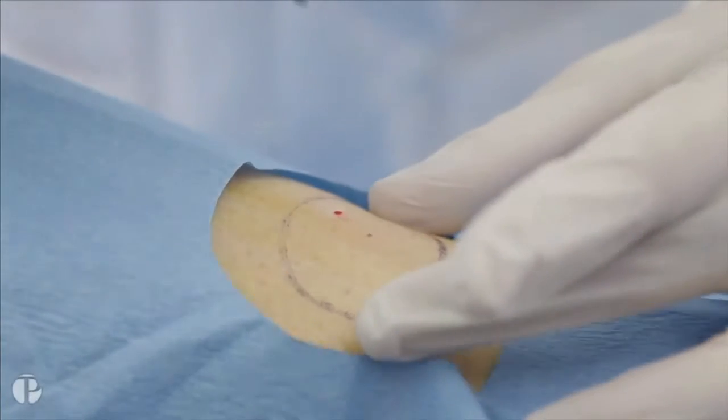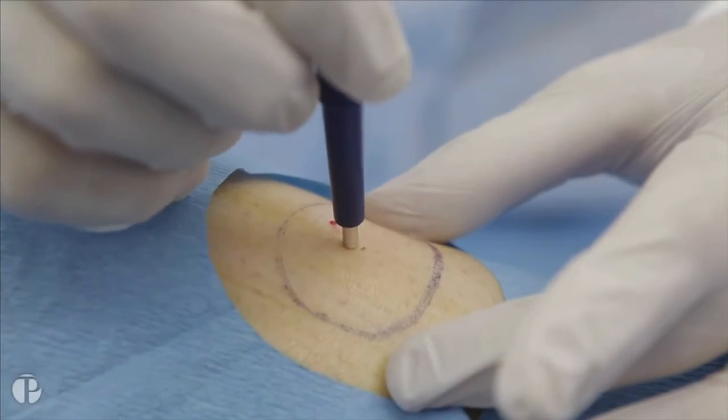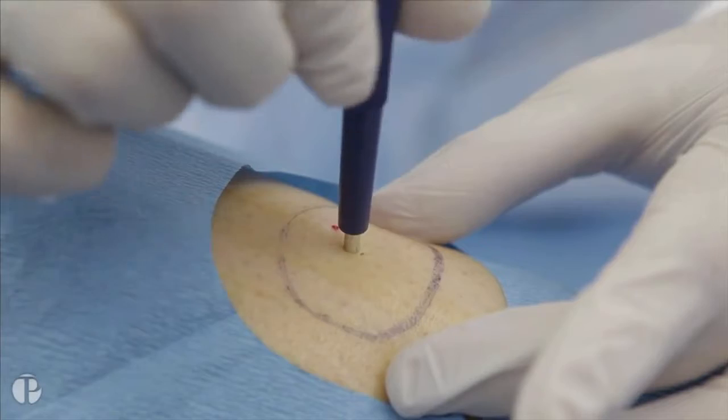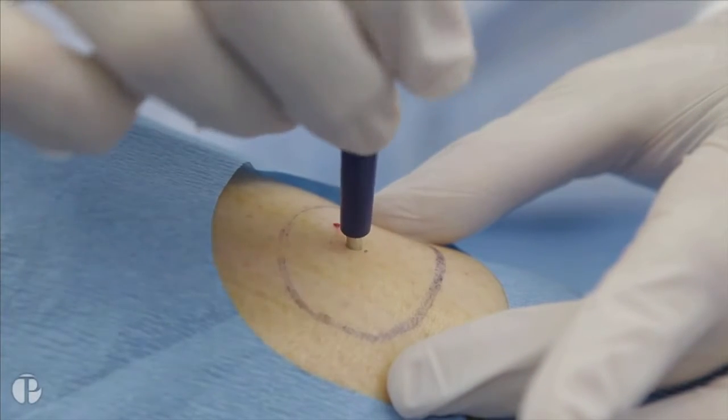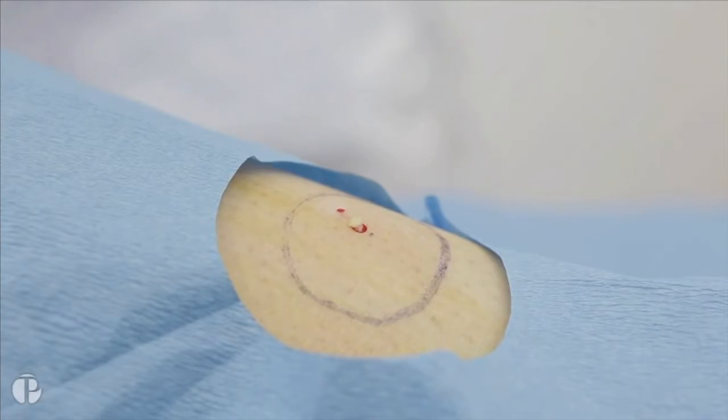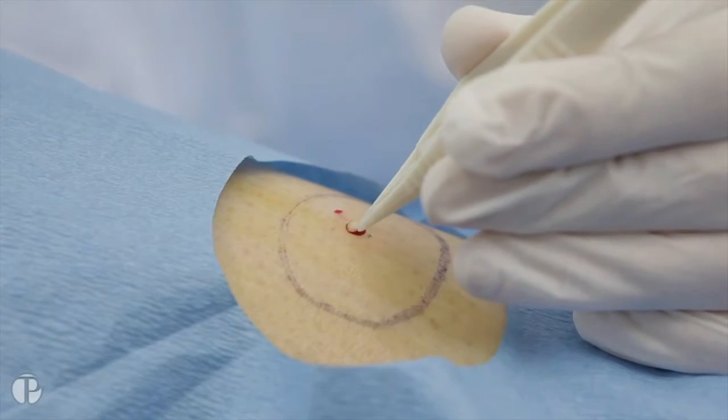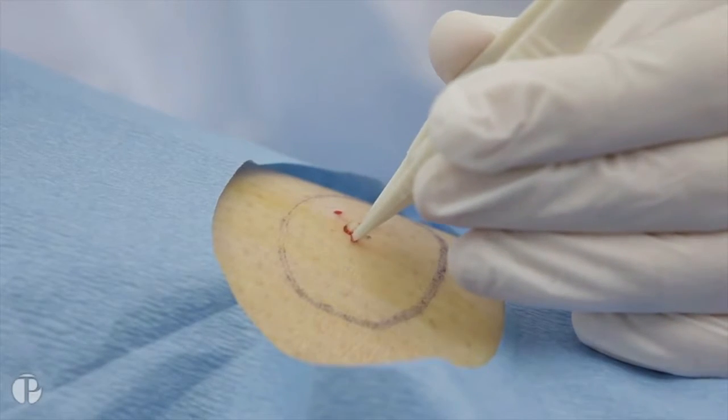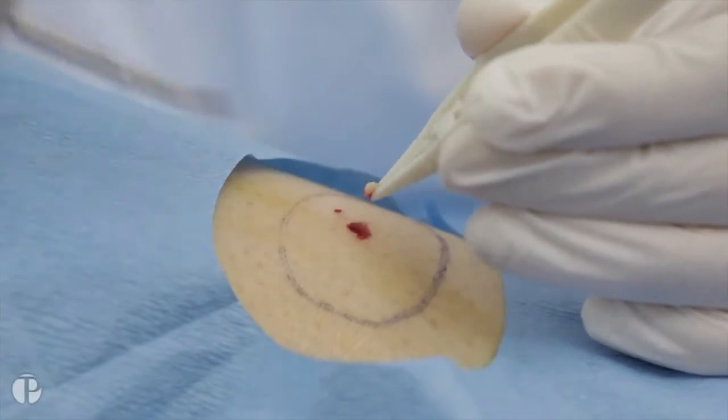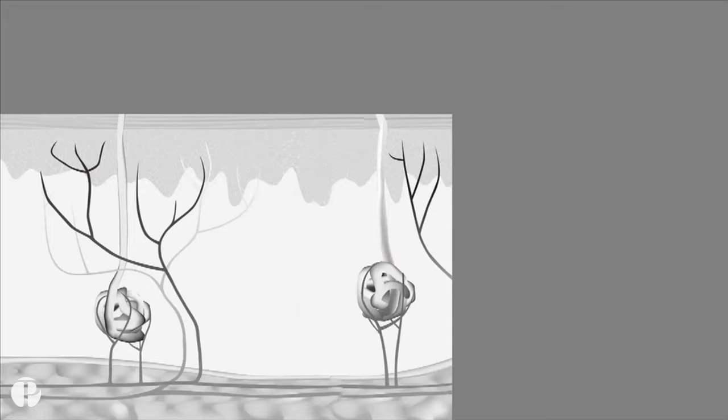Apply pressure to the skin with the punch tool. As you are applying pressure, rotate the tool back and forth so that it punctures the skin. Insert the tool the full distance of the metal head and remove the tool from the site. With the forceps, carefully grasp the sample from underneath the epidermis and use the scissors to remove the sample. Should the sample remain in the metal head of the punch tool, use the plastic stylus to eject the sample into a vial.